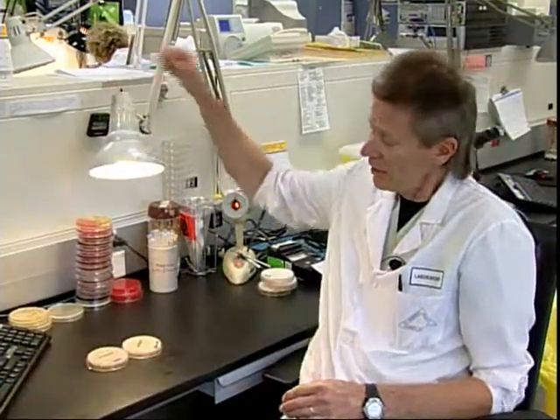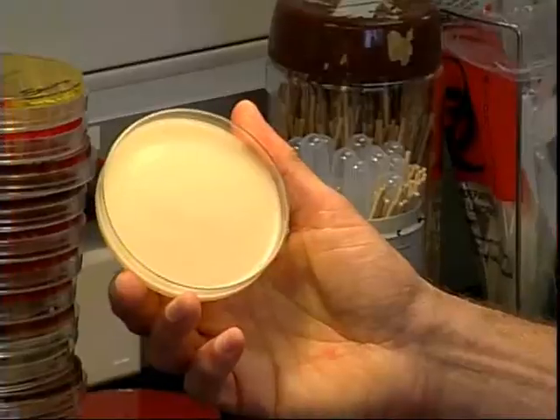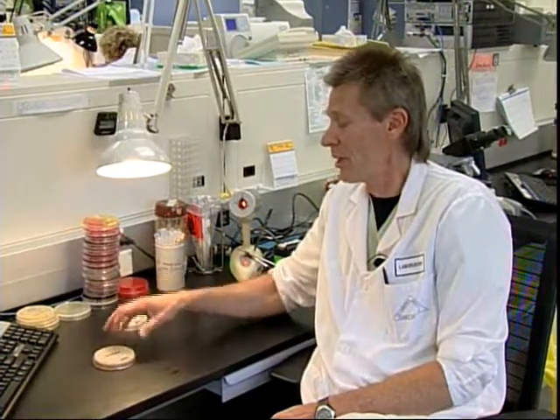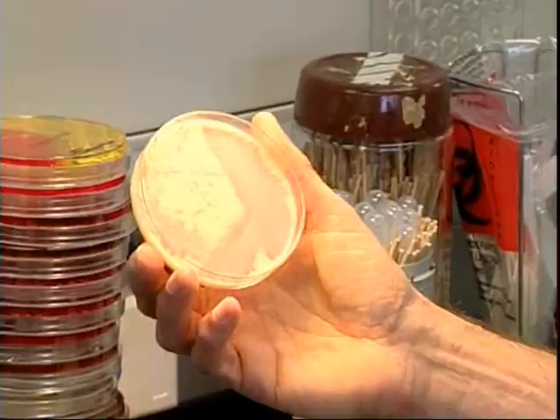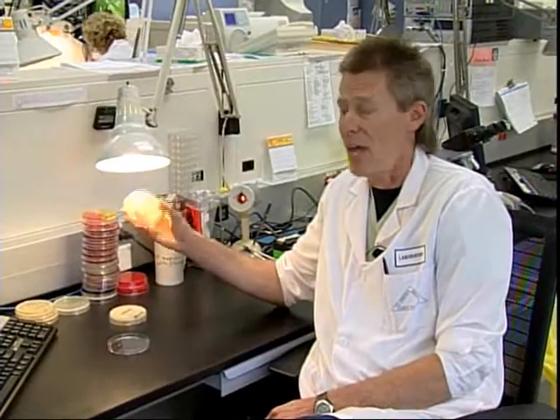So if this organism grows on the agar and it's a mauve color, it means it's Staph aureus MRSA, methicillin-resistant Staph aureus. And that's all there is to it. The plate is inoculated and it's incubated 24 hours. If there's no mauve colonies or no growth, the report goes out in 24 hours as methicillin-sensitive. And if there's mauve colonies, we know they're methicillin-resistant and that they're MRSA. So MRSA plates are out in 24 hours, whether they're positive or they're negative.